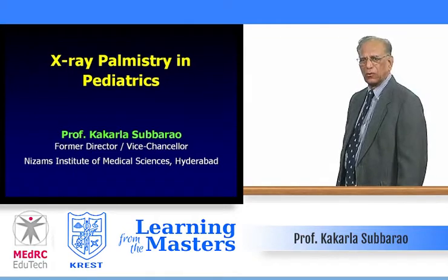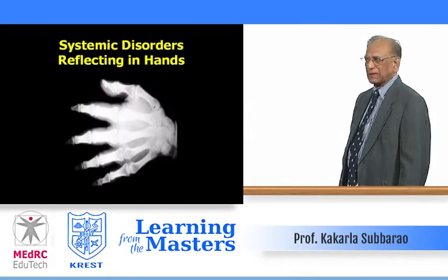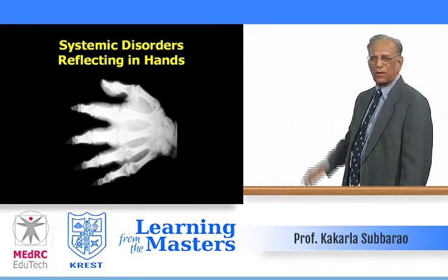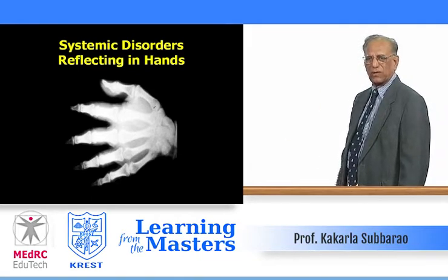Today we'll be speaking on X-ray palmistry. It may sound mystical, but systemic disorders, several of them reflect upon the hand X-ray. Remember, Röntgen for the first time has taken his wife's X-ray when he discovered the X-rays.